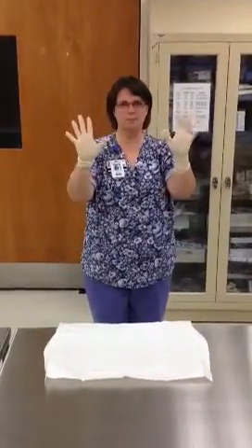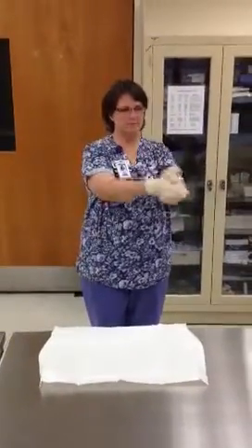You can readjust if you need to at this point. You don't want to worry about your wrists because you're only going to be using your hands and your fingers. You can then go and set up your table, but make sure your hands stay above your waist at all times. If they fall below your waist, your hands will be considered not sterile.